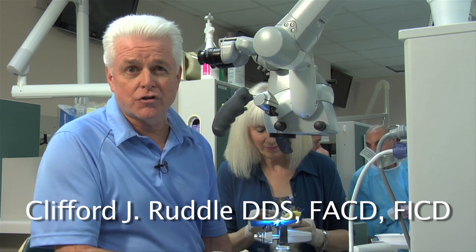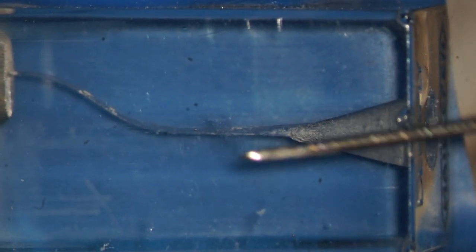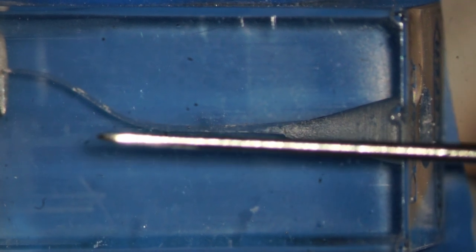And guess what? I got the short straw, so I have to do the demo on the S block. You can see we already have straight line access. There's a nice well. There's a straight away portion of the canal.